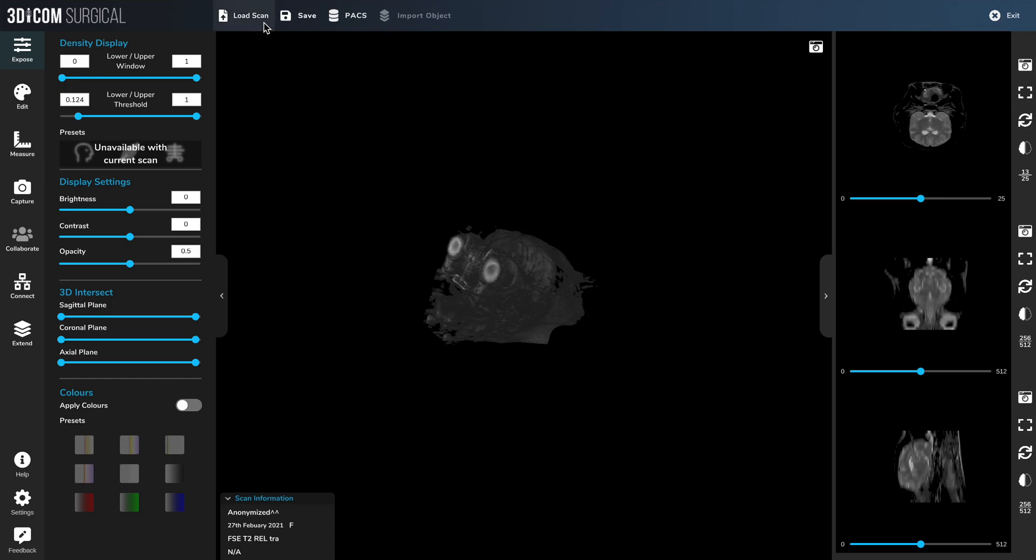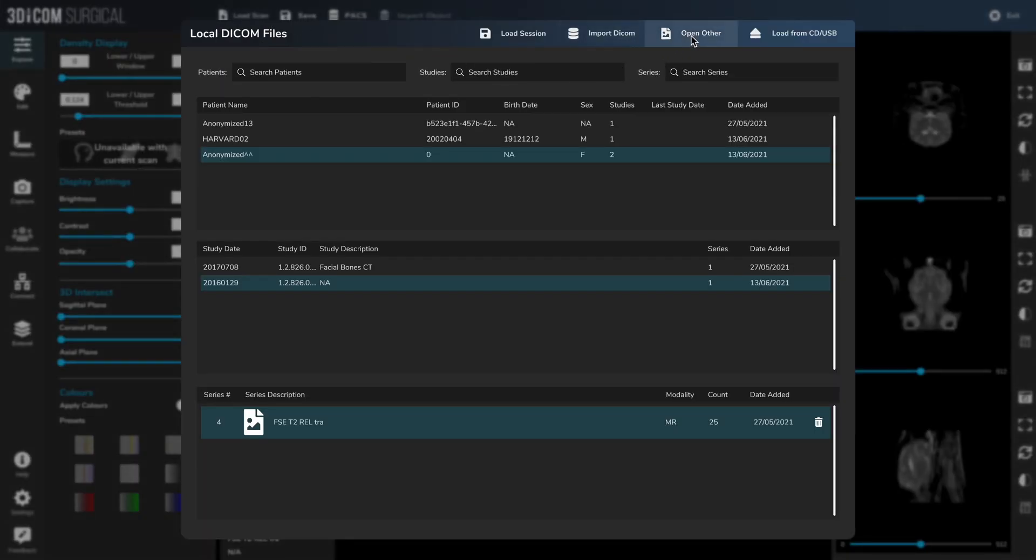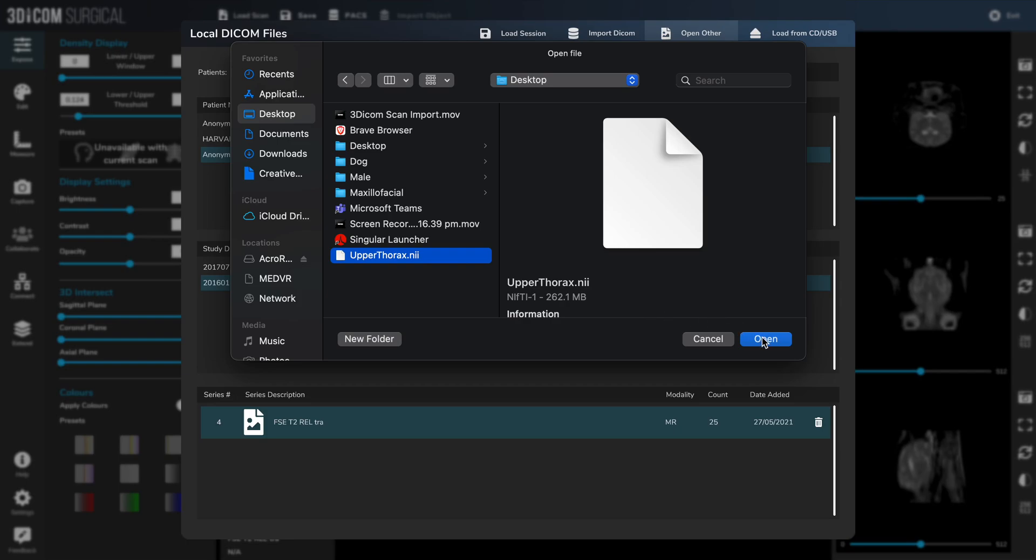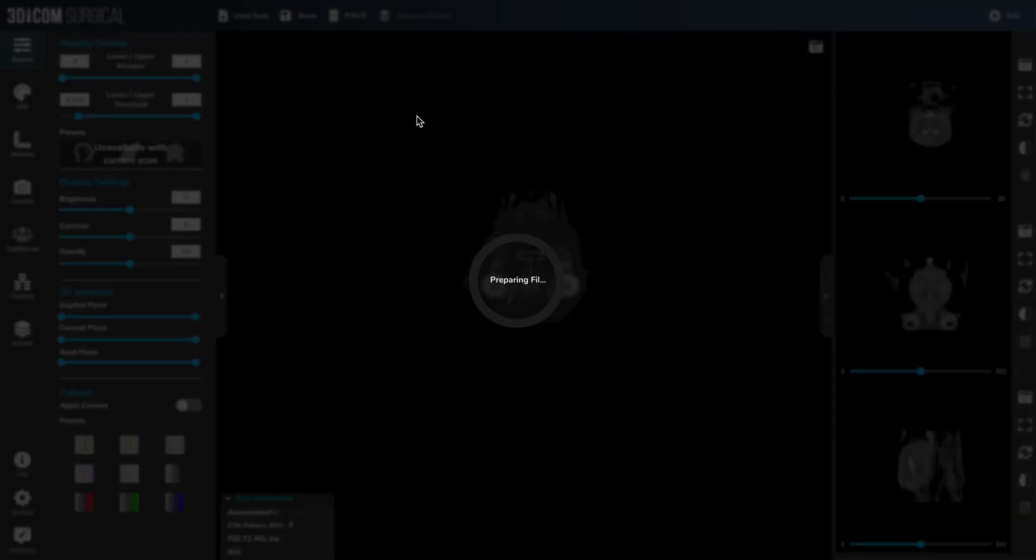You can also load in Nifty scans by going open other, navigating through until you find a .nii file. Click on that and this 262 megabyte file will open without actually being cached in the local archive.